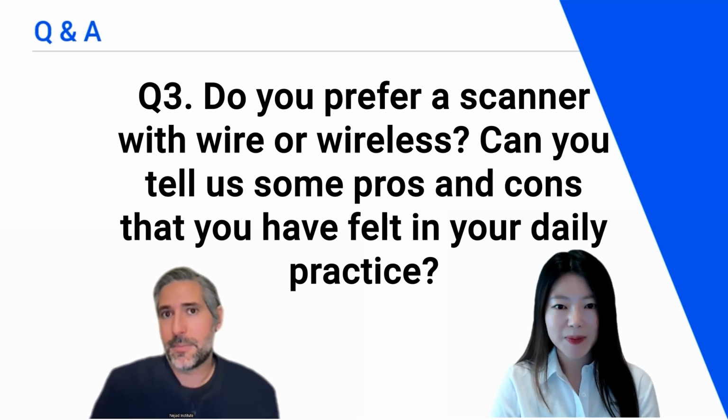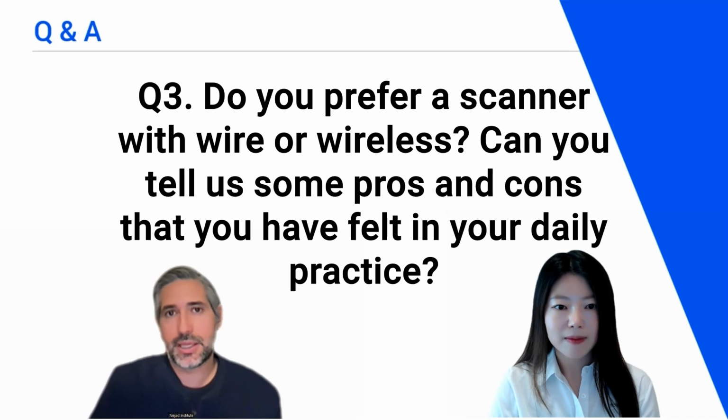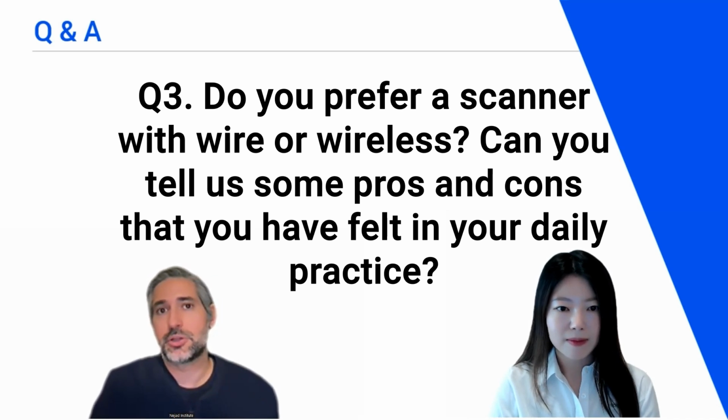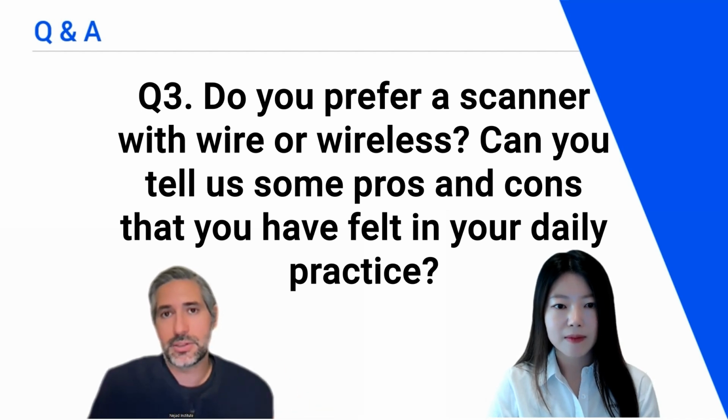Yeah, so I have both, but I'm only using the wireless now. At first, I would say the wired was faster and smoother. No longer the case. I don't notice if it is faster or smoother. It's not to the point that I notice it. And I'm not even trying to compare it because I no longer feel like I'm waiting for the scanner to connect or get signal. So I always use the wireless now.